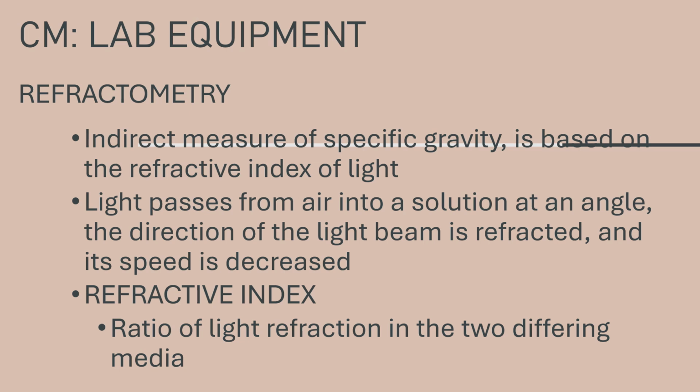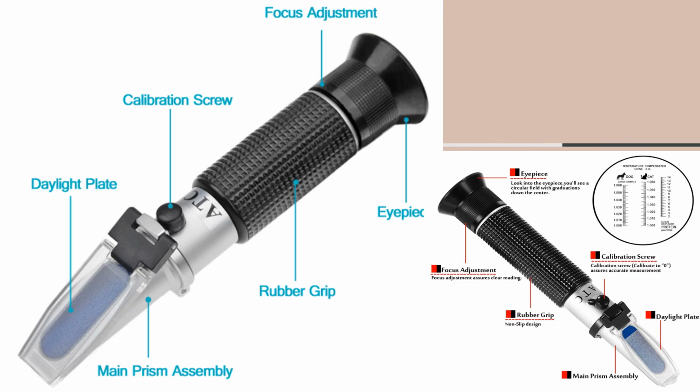And yes, your refractive index is the ratio of your light refraction in the two differing media. This one is an image of your refractometer. This area here is your sample plate.